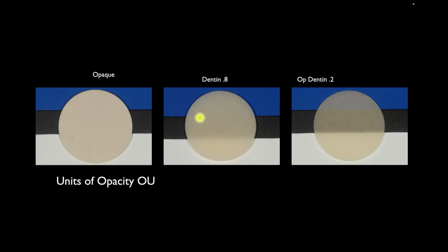the challenge there is what you're missing: the opacious materials are more opacified, but that is really based on thickness. Because they're more opacified at 1 millimeter thick, it would look almost more like that. Problem is you never have a millimeter thickness to work with opacified materials.